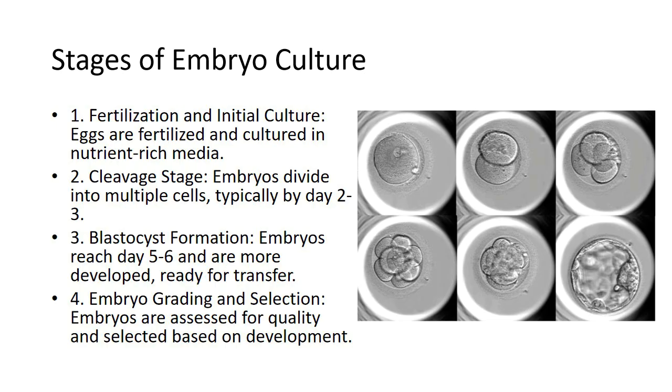Embryo grading. During culture, embryos are assessed for their quality and development. Embryo grading involves evaluating the appearance, shape, and rate of division of the cells. Embryos with consistent and organized development are graded higher and are more likely to implant successfully after transfer.